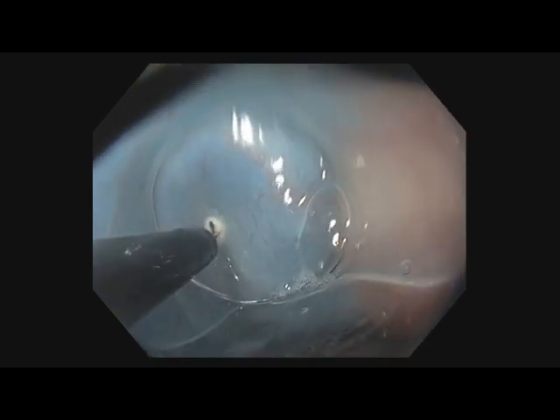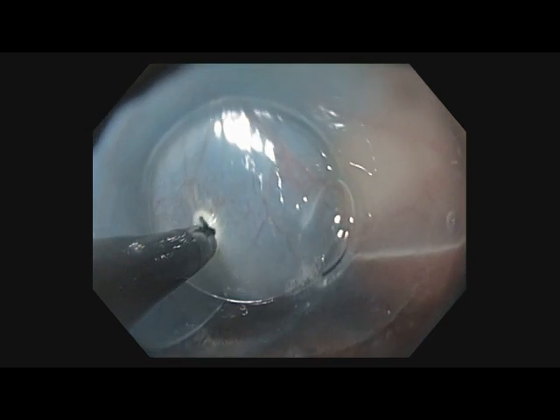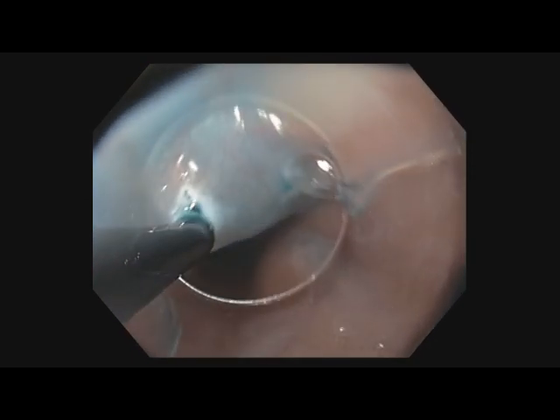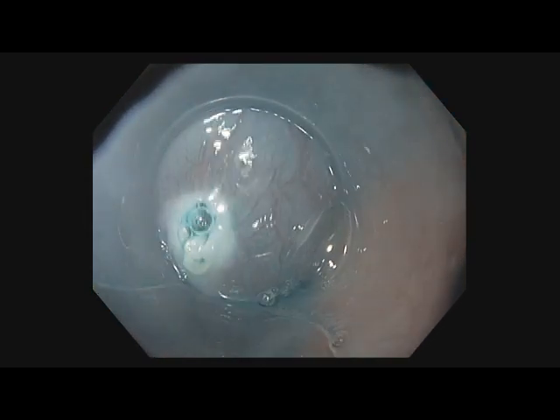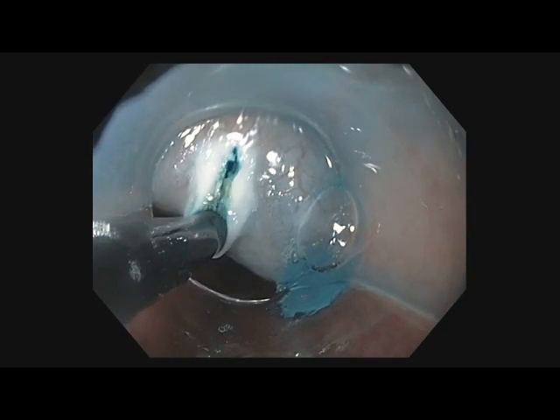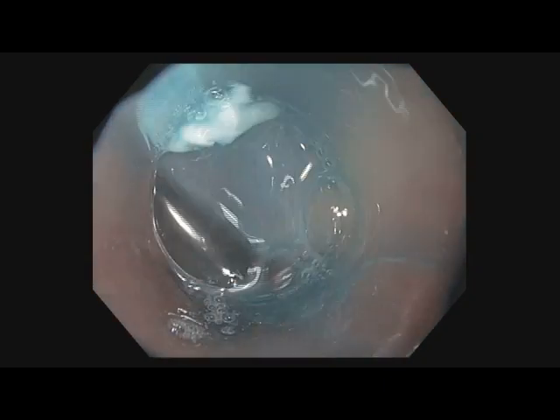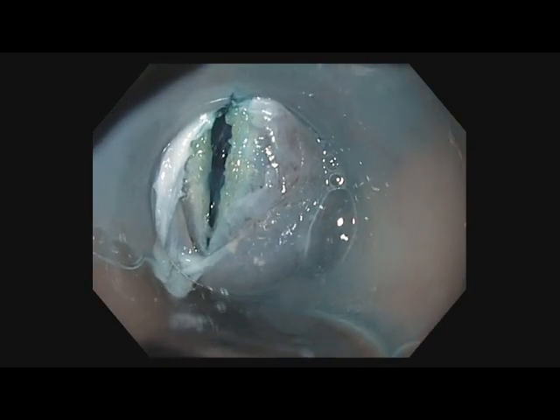In this patient, a 2 cm long longitudinal mucosotomy is performed 16 cm proximal to the esophagogastric junction to initiate the submucosal tunnel. Using principles acquired by experience in endoscopic mucosal resection, the mucosotomy is initiated proximal to the myotomy start site to enable a proximal safety mucosal flap of 3 to 4 centimeters.